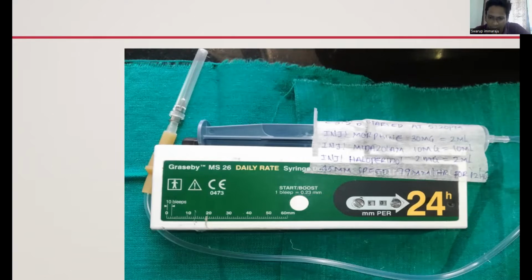Once you start using this infusion, which is a parallel or alternative route of administering the medications, do not delay, because the patient is already in pain. That's the reason why when he was conscious, he was put on oral medications like morphine. And once, due to different situations, the patient's performance has become poor and there is nothing we can change, still there are a few things, like changing the route of administration, that are more important.